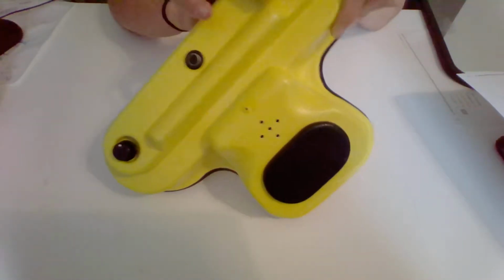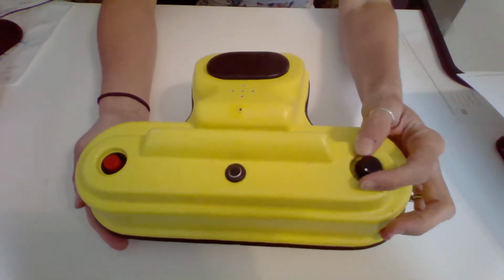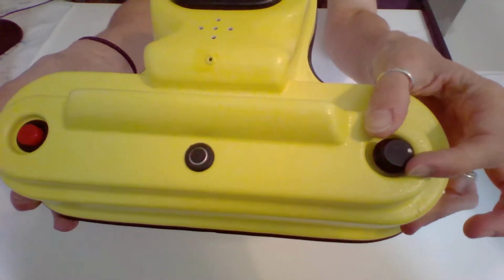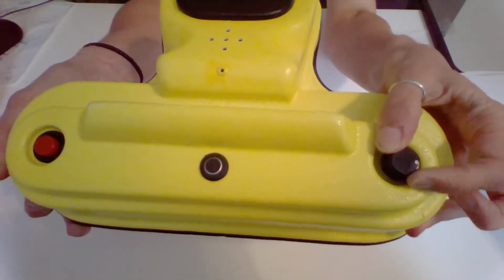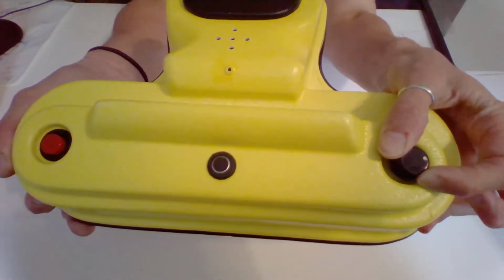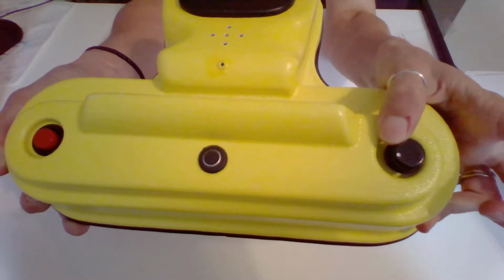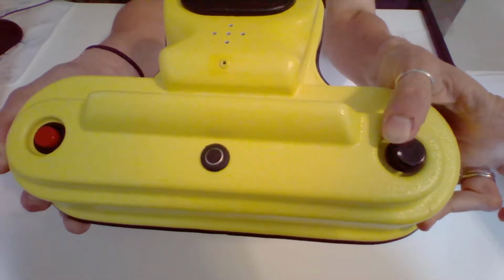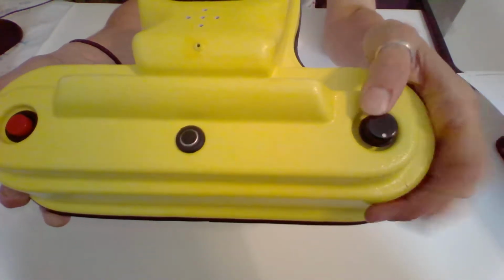On this side of it, I'll turn it upside down so you can see that a little better up close. On this side of the device, you have the volume. Now, you see there's a little white dot on there. That kind of indicates where the volume level's at. So it's off, you hear a click, turn it on, another click, and then just keep on turning that button, and this would be high volume. So you can adjust the volume a little bit. Like I said, not fancy schmancy, high tech, just super simple. Okay, so turn off for a minute.